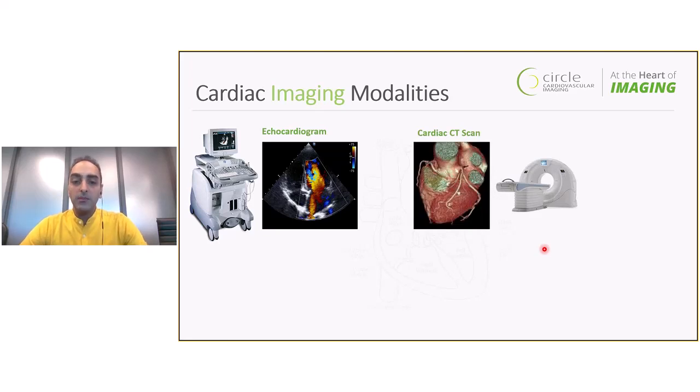It is important to note that CT angiogram uses X-ray radiation as a source of imaging, and this is potentially harmful to the patient. But due to the high resolution of CT imaging, we're able to visualize small structures such as the coronary arteries, and to assess if there's a blockage happening in these important arteries, and see if there's a potential problem there.